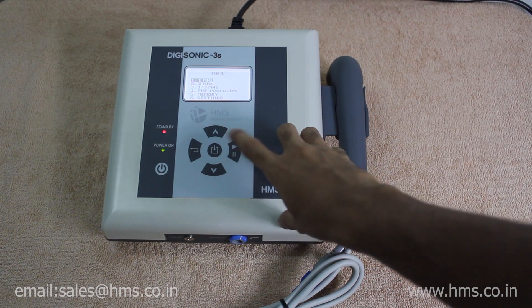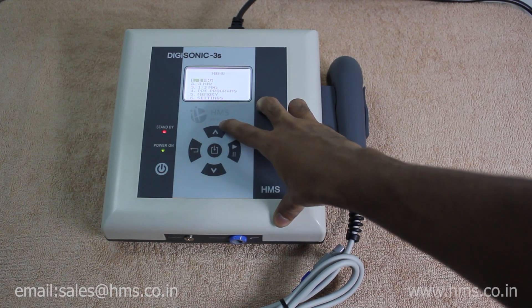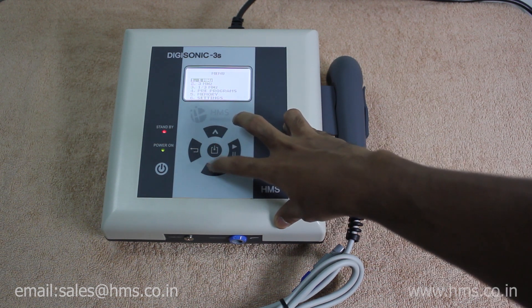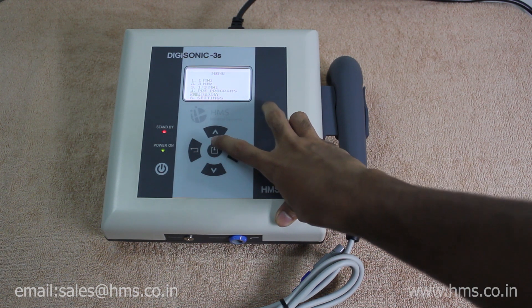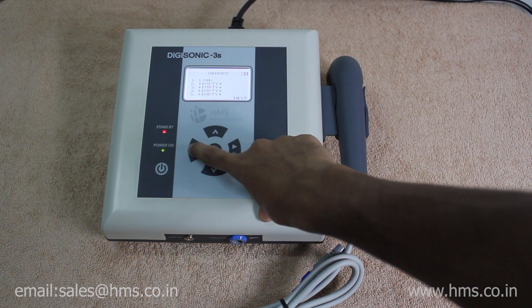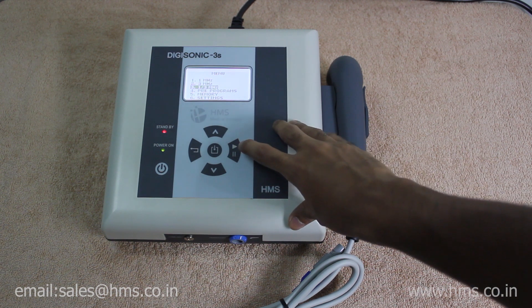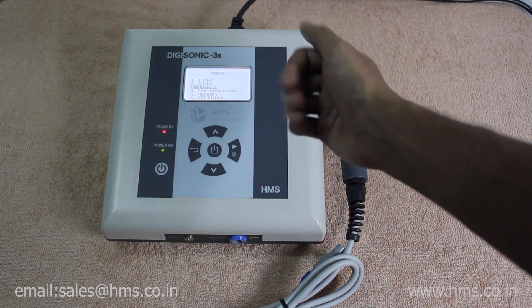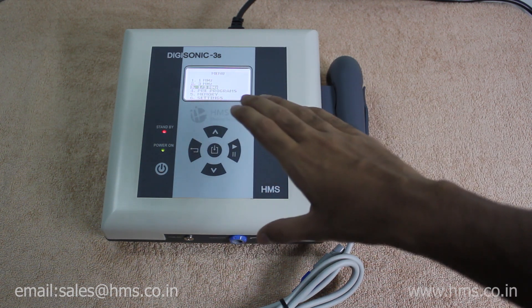Now we'll go through the key switch functionalities. These two key switches at the top and bottom are used to navigate around the menus. The middle button is used to select the menu, the left button is used to go back, and this button is the start/stop button to start the treatment.